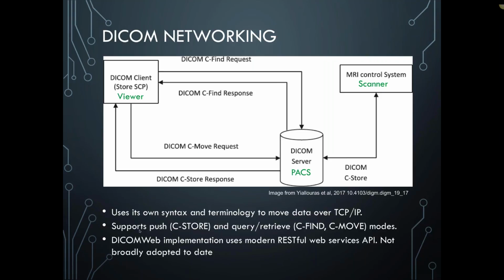But nonetheless, they've been responsive to those of us who've been asking for more modern networking protocols, and have implemented a thing called DICOM Web, which provides RESTful web services for doing these same kinds of communications. It's a relatively new part of the DICOM standard, and so it's not really broadly adopted to date, but hopefully will be coming in the coming years.